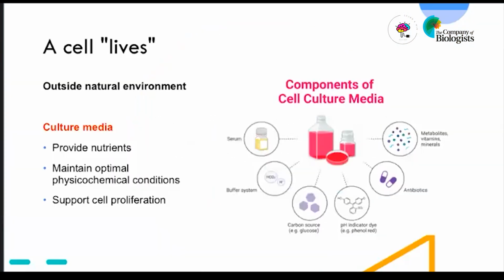As you know, cell culture is the process of growing and maintaining cells outside their natural environment, thanks to the culture media that provide nutrients like amino acids, vitamins, minerals, energy sources to maintain optimal physicochemical conditions such as neutral pH, and to support cell proliferation with specific growth factors.